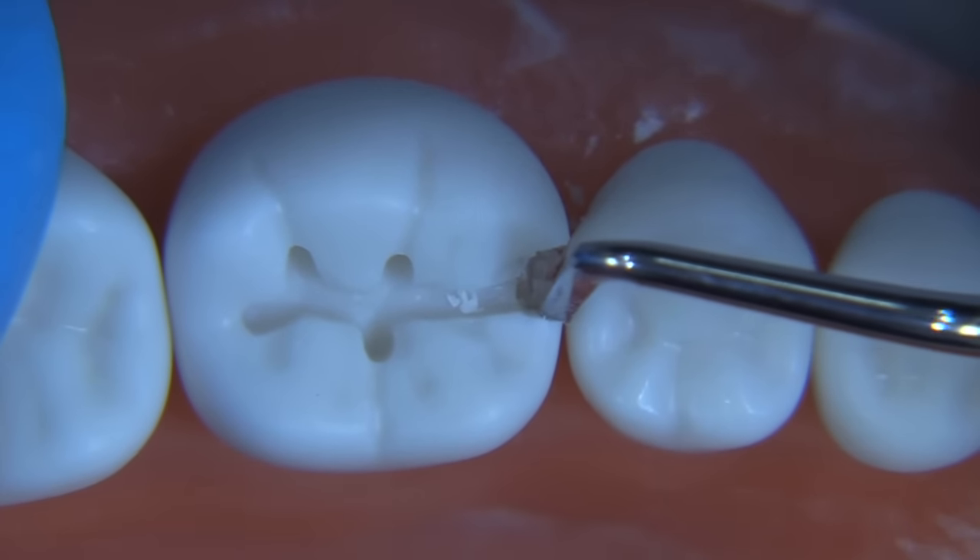The preparation is nearly complete. Perhaps it's not perfect — I don't think that's always possible, but it's certainly our goal. The RGS1 is showing you the 1.5-millimeter minimum depth and the 0.4 to 0.5-millimeter clearance. The RGS3 at one millimeter shows a one-millimeter isthmus width, with one-millimeter extensions up the secondary grooves — two on the buccal and one on the lingual. Notice there is no adjacent tooth damage whatsoever by following the techniques outlined in this video. It was great to spend a few minutes with you; give me feedback — always here to help. All the instruments, the typodont, the hatchets, and the burs are all available from stevensondentalsolitions.com for speedy delivery.